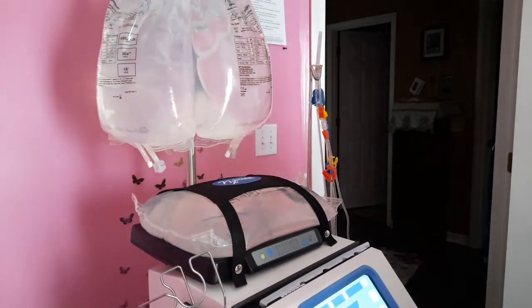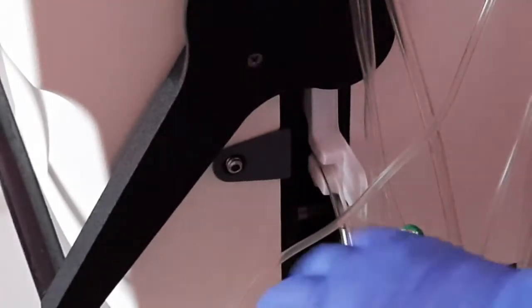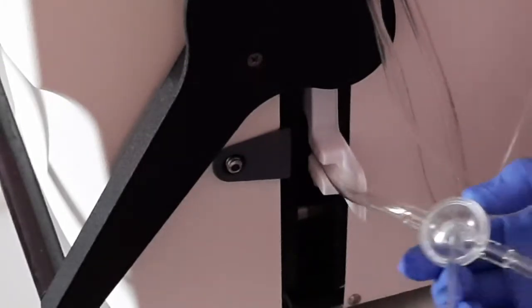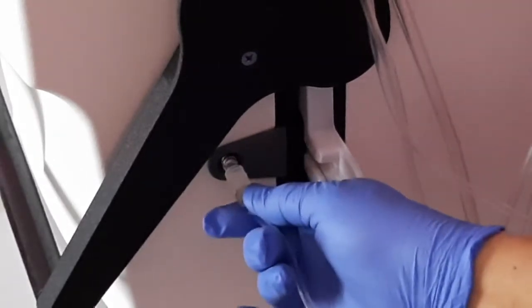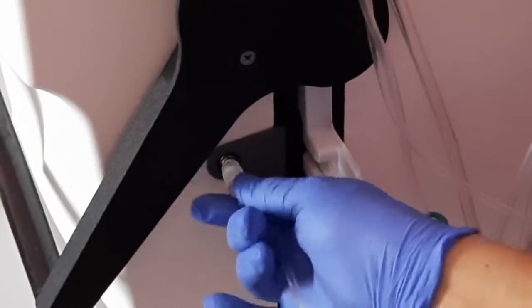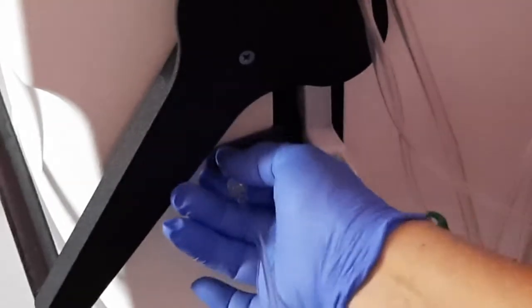And we have the dialyzer here. So we have pushed down. Now this is an important part here. Okay, so now we're on the other side of the cycler. And this is where we get the pressure pod, which is, as you can see, a little circular disc. And inside, there's a membrane in there. So we're going to take that short cord, and we're going to find this little entry point. We're going to push in to the left, turn to the left, and then move our fingers up to the top where the seal is and turn the seal to the right and screw that in there. And now your access pressure pod is in there.